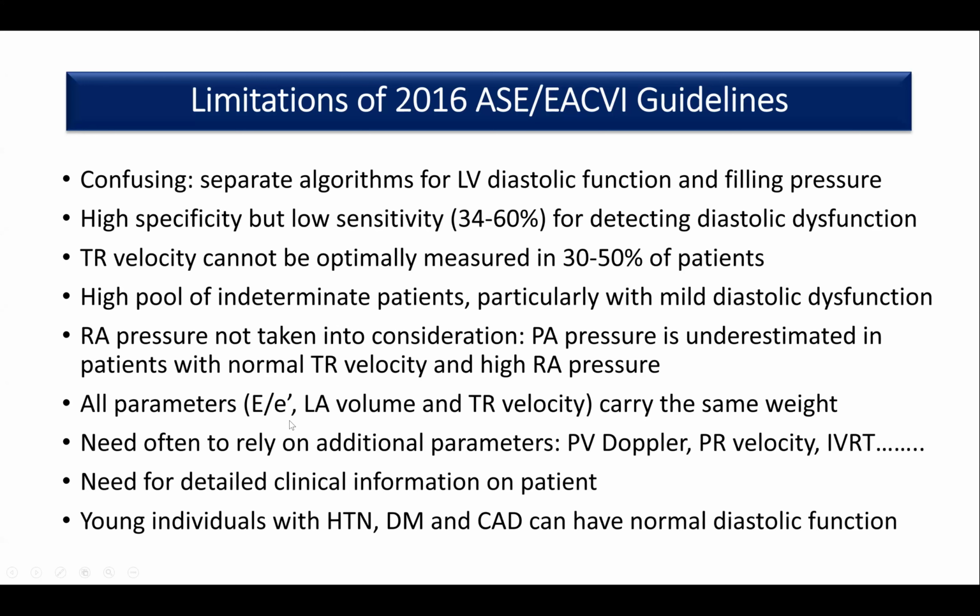Additionally, all parameters, E/e', LA volume, and TR velocity, carry the same weight. Obviously, it cannot be the case. I mean, we cannot really say that the E/e' ratio is as important as LA volume, as important as TR velocity. Some of these parameters should carry more weight than others. For example, the E/e' ratio should certainly carry more weight than the TR velocity, which we don't get half the time, and the LA volume, which we can easily underestimate.